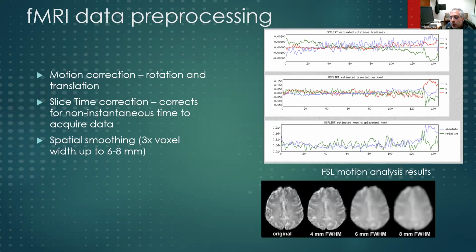So once we've obtained our BOLD signal, and down here is an example of what it might look like. So you've got a BOLD signal. This is the whole brain. This is a representative slice axially through the brain, but you would have the whole brain. And for every voxel at 4 millimeter resolution, a 4 by 4 by 4 millimeter cube, you would have a time series over the entire 5 minutes where the patient was going back and forth between performing a task and doing a control rest. And so we have time series data for each and every voxel, and the patient moves their head.